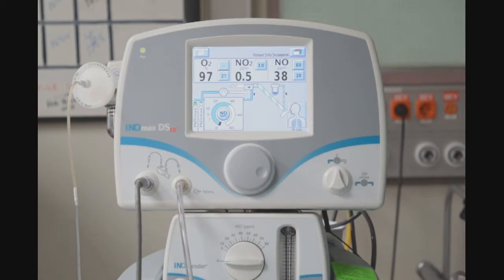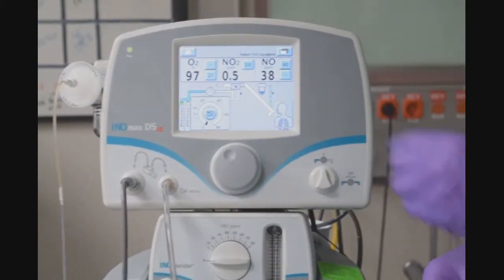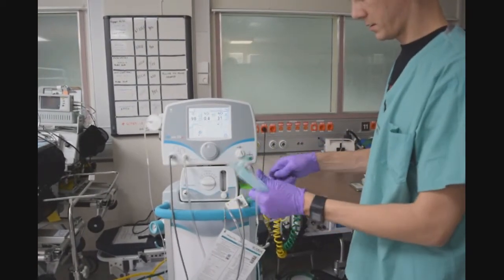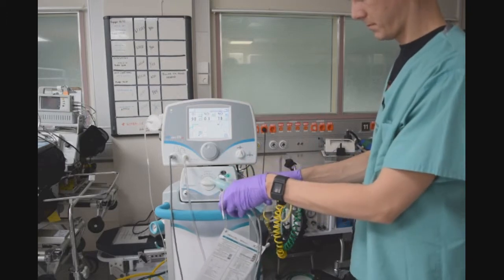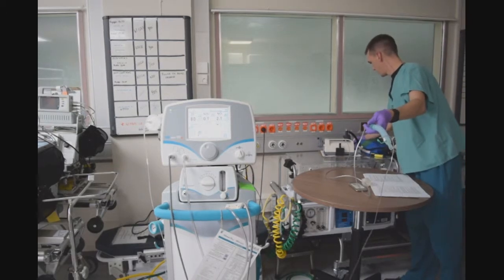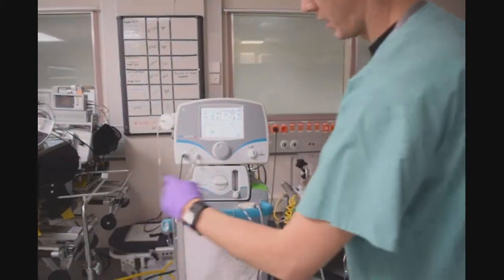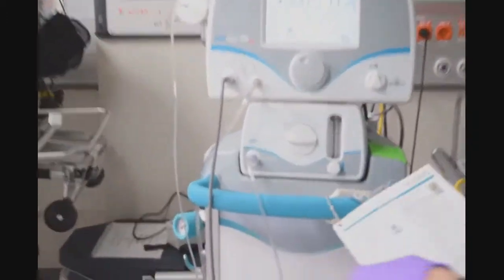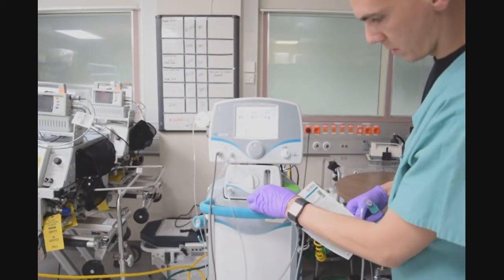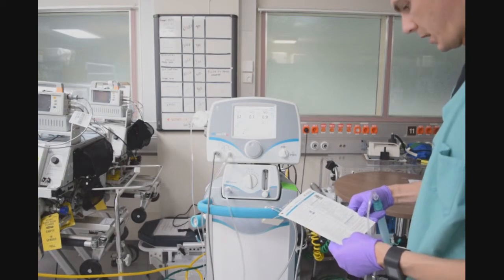Next, I will perform the INO blender test. I am going to turn the dose down to zero. I will get my message that I turned to zero. I will take out the injector module from my setup and I will take my oxygen tubing from the wall and place it on the INO blender. I will set my dose to 40 parts per million and my flow to 10 liters, giving the device a minute to stabilize.